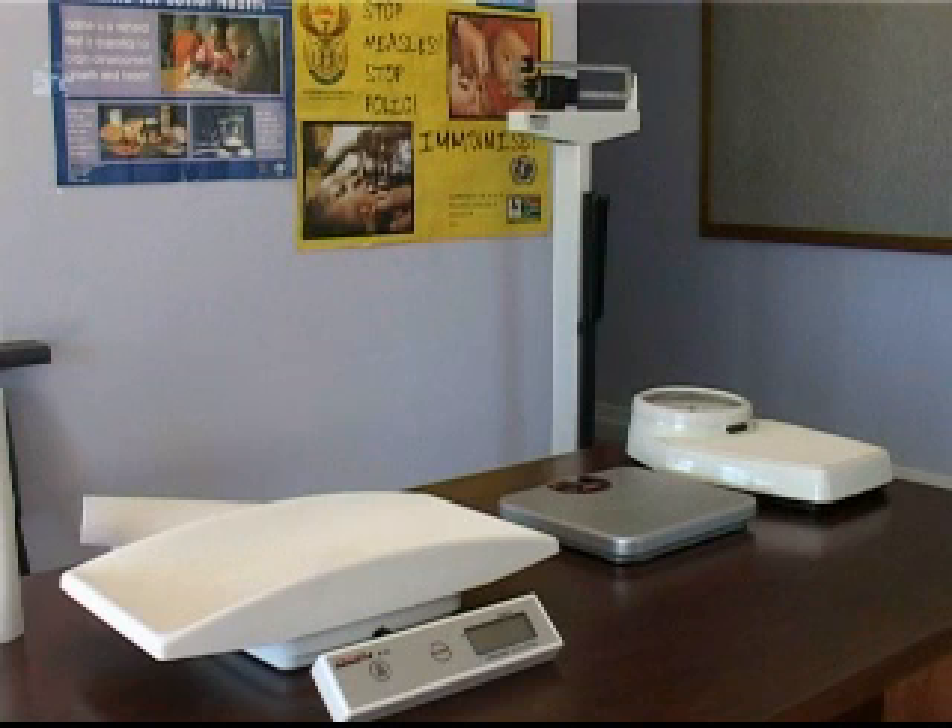Weighing scales are used to measure the weight of adults, children and infants. There are different types of weighing scales.